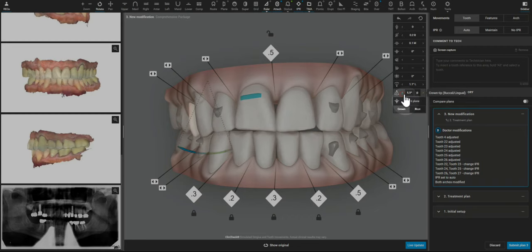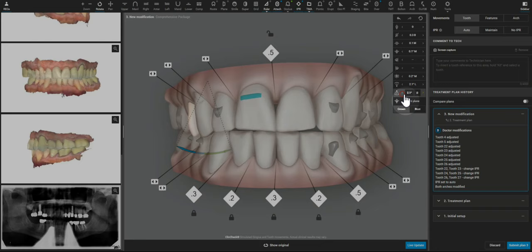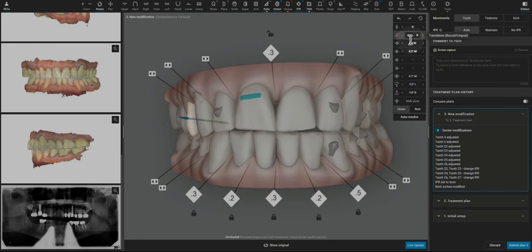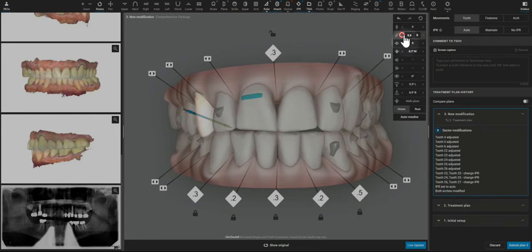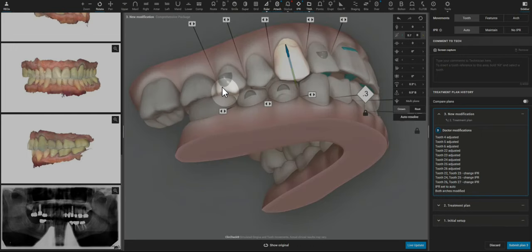Whenever we see a premolar with a little bit of a lingual inclination, then I want to upright that and then do as much expansion as I can that looks like it fits within the arch form.